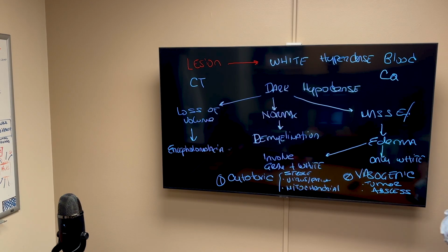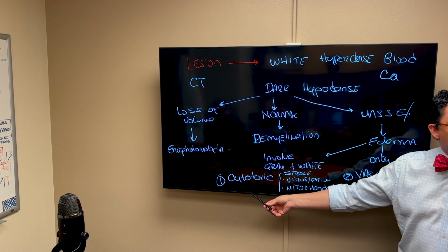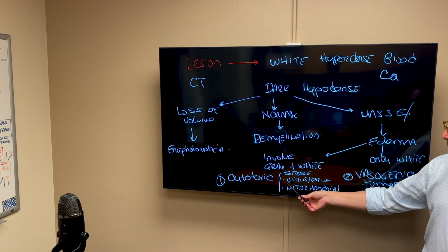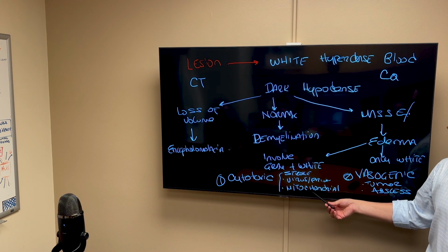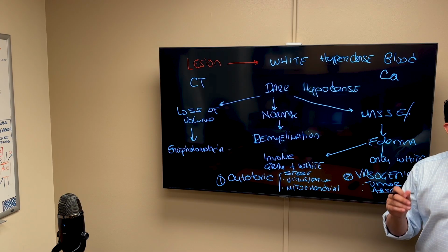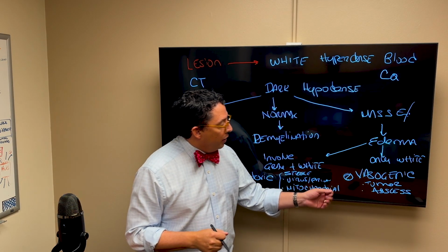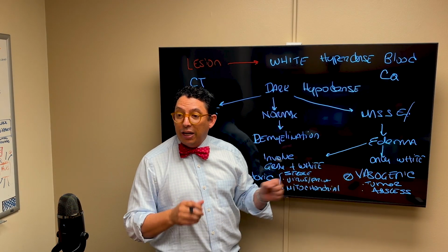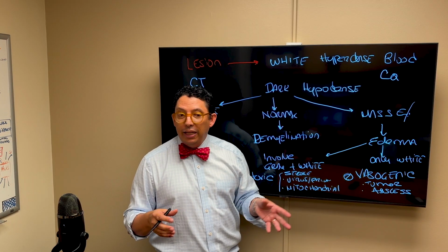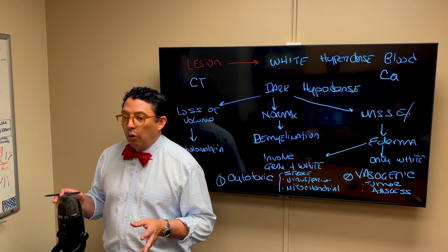There are two types of edema in focal hypodense lesions. One is going to be the one that involves gray and white matter, which we call cytotoxic, which can be vascular because of a stroke. It can be because of viruses and prions or mitochondrial encephalopathies. These, the virus, prions, and mitochondrial, tend to affect mostly the gray matter because that's where the somas are. And the other one is vasogenic edema. Vasogenic is a leakage of the water. When that water leaks into the extracellular compartment, it leaks into the white matter mostly, and you have to think about a tumor or a mass.